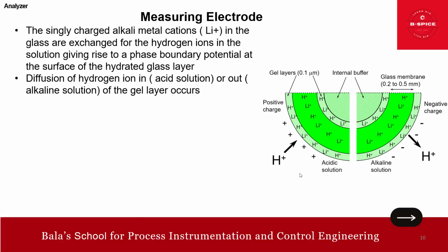Diffusion of hydrogen ion into the gel layer occurs in acidic solution, or out in alkaline solution.